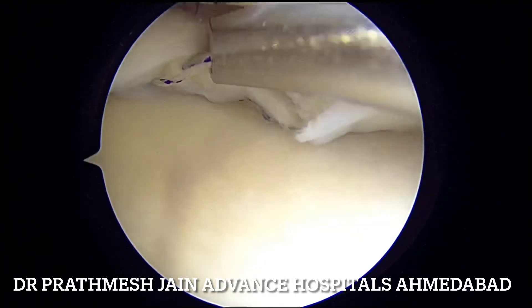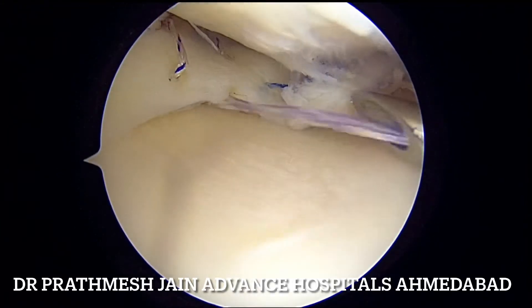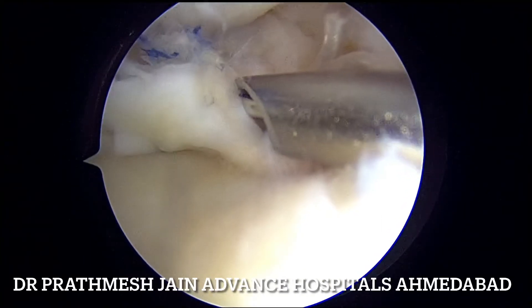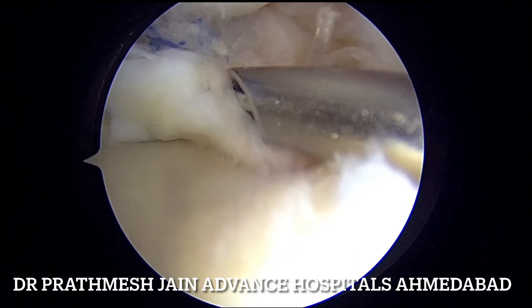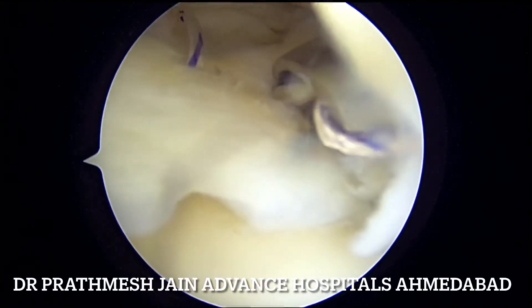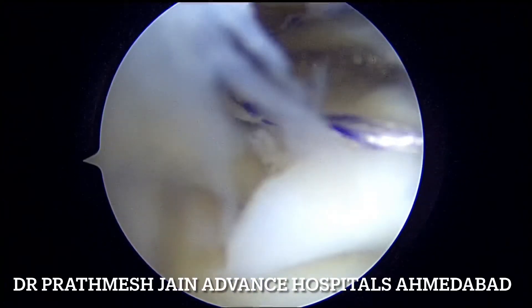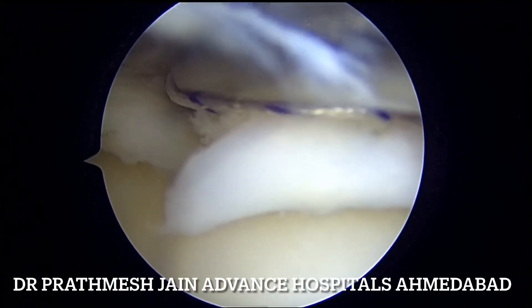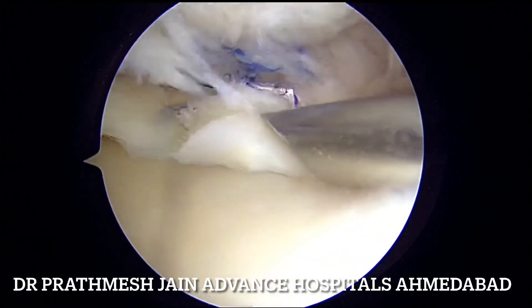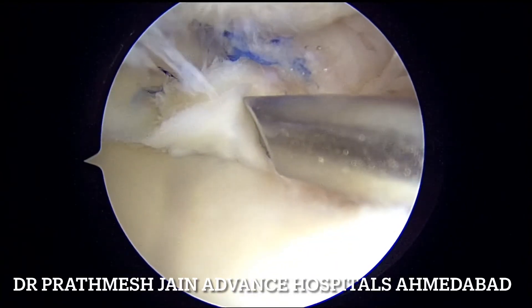Once all sutures are placed, here is what we have done: we reduced the radial component using a root fix anchor, which reduces it nicely. We then passed two side-to-side sutures to close the radial component further. The root fix anchor stabilizes the tear better and reduces the posterior flap which usually flips up — the flipping superior posterior flap can be reduced nicely with the root fix anchor.